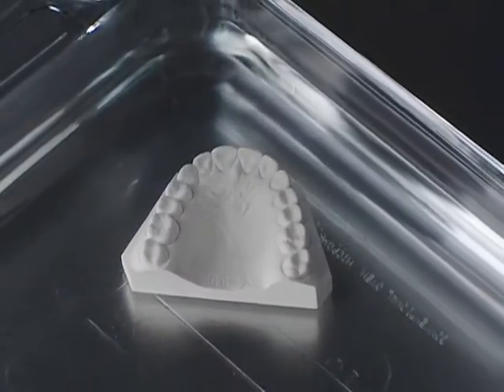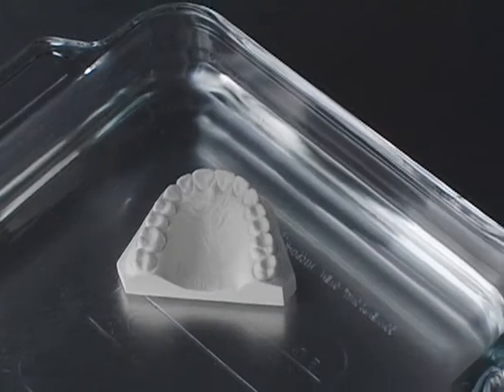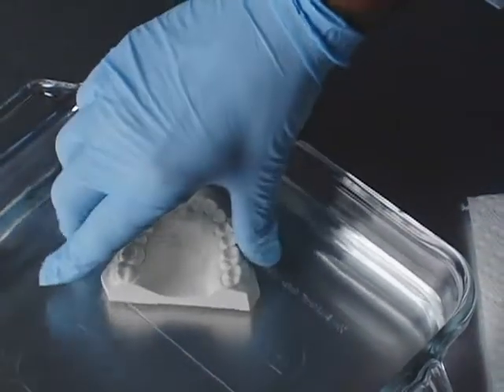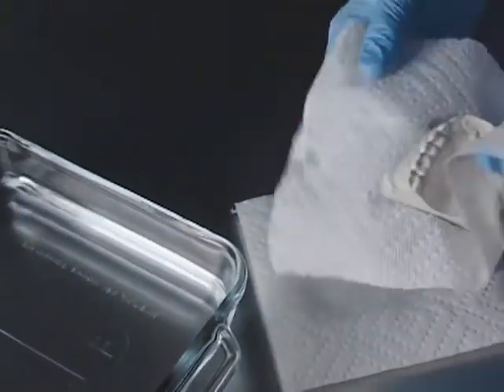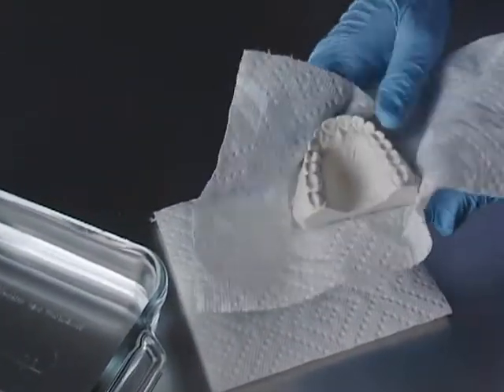When you use the AquaPress, first soak the stone model for about five minutes. Otherwise, it will absorb water later when placed in the AquaPress, and that will keep you from maintaining proper pressure.